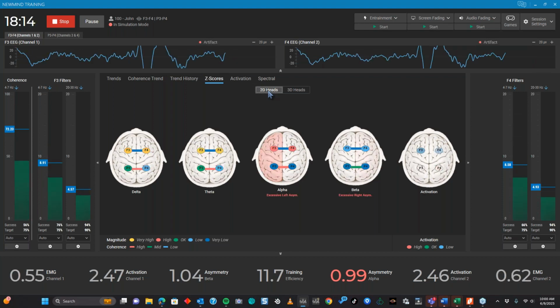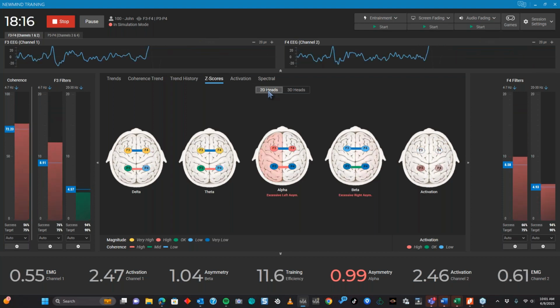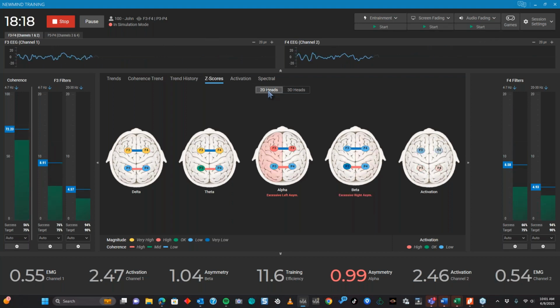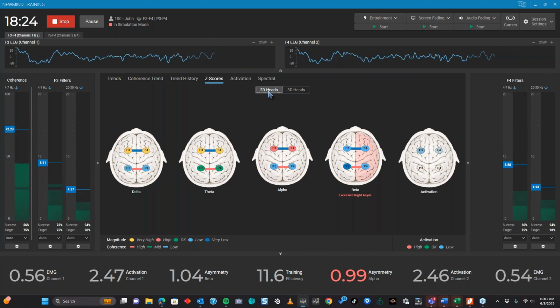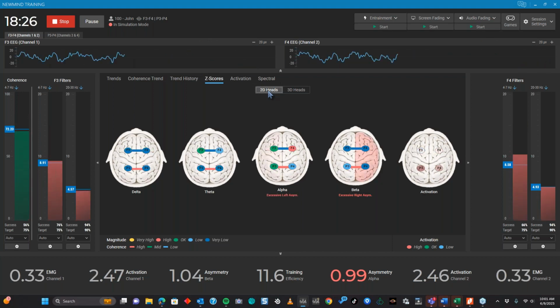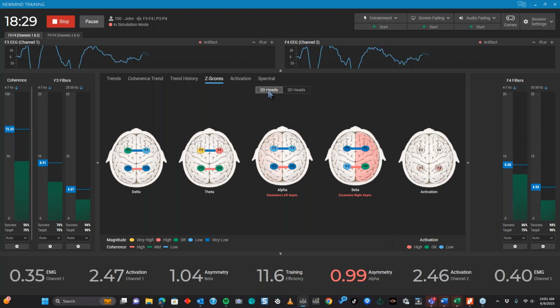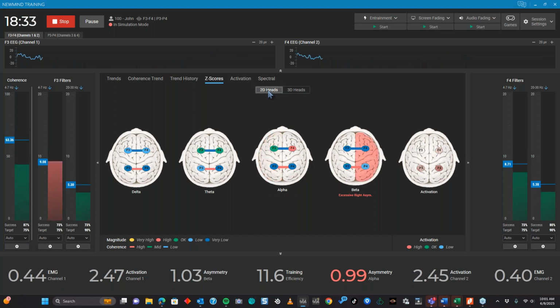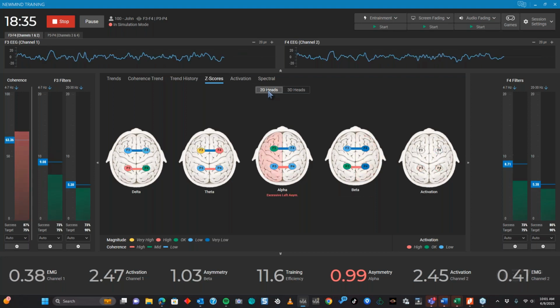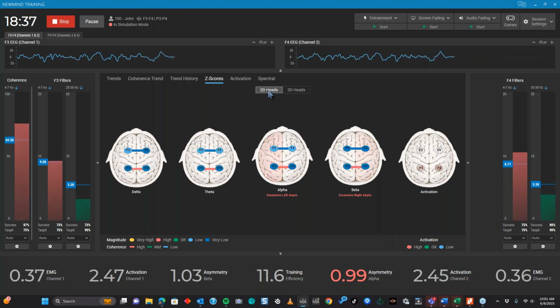The client came in, and after we finished with the map, told me that their fire alarms were going off in the middle of the night and that she didn't sleep well that night. And so then I was like, oh, I wonder if that's why your map looks so crazy, like from the last one. Could it be because she didn't have a good night's sleep, and she doesn't typically have sleep problems? And so then I started thinking, well, maybe I need to remap her. Can I trust this map that we did?